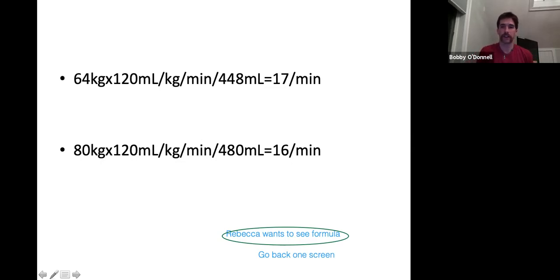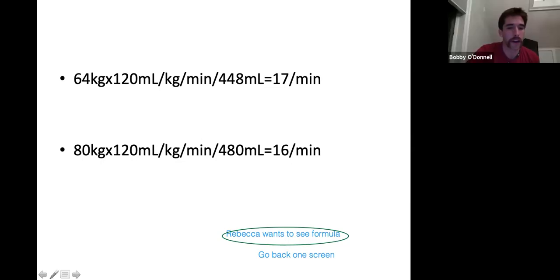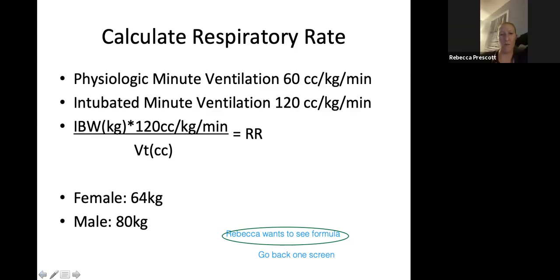I'll let you... Okay, sorry. Go back again. Go back in. Yep. This one right here. You lost me on that one.